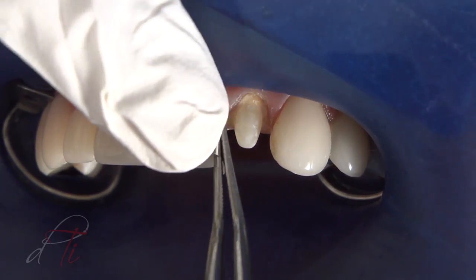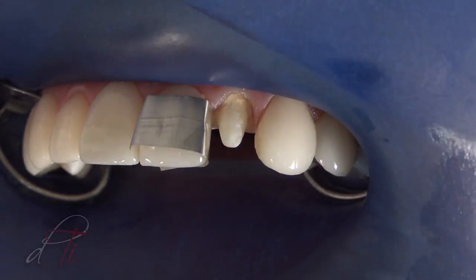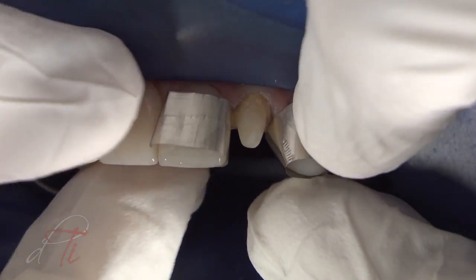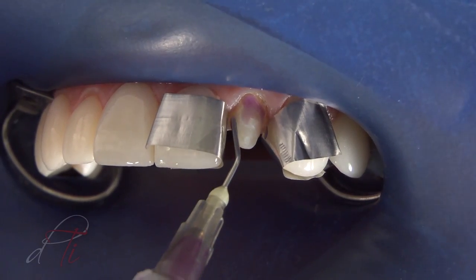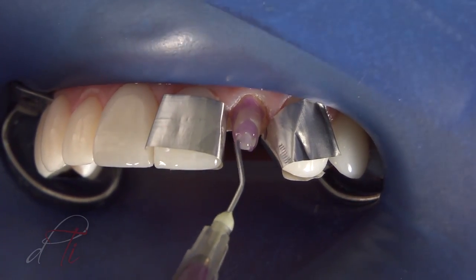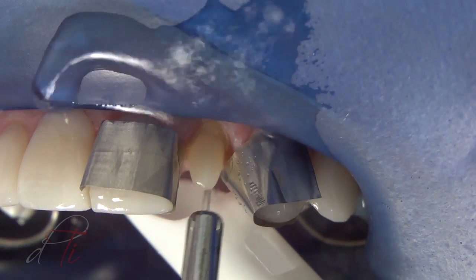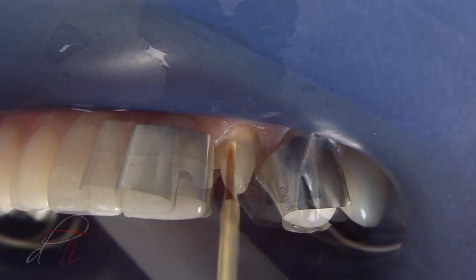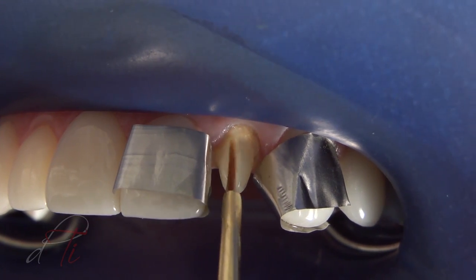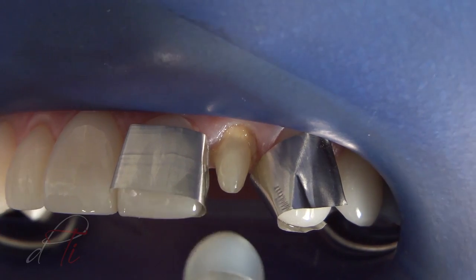The last step to the preparation is the resin coating technique. Dead metal matrices are placed around the adjacent teeth, and the preparation is etched for 15 seconds with a 37.5% phosphoric acid semi-gel, rinsed for five seconds, and excess water is removed, leaving the preparation visibly moist. A thin coat of adhesive primer is applied to the moist preparation, air-thinned, and light-cured for 10 seconds. The surface should appear shiny; otherwise, repeat the process.